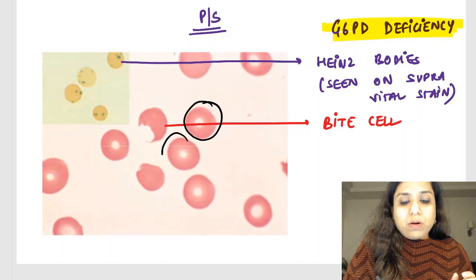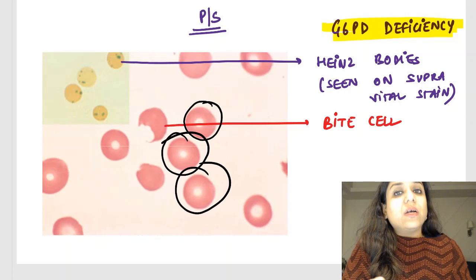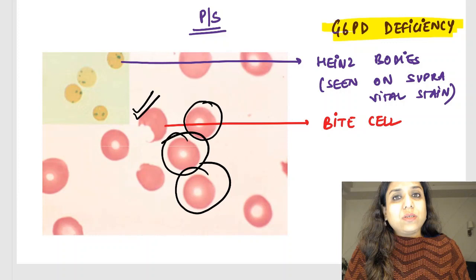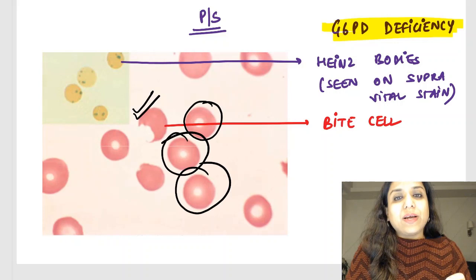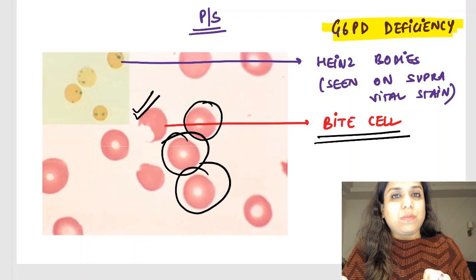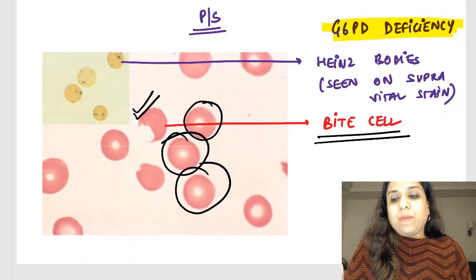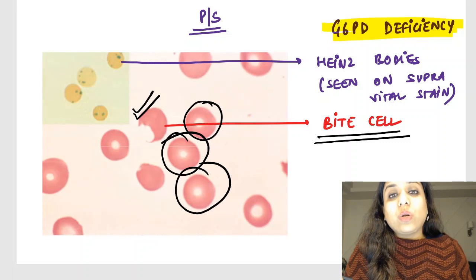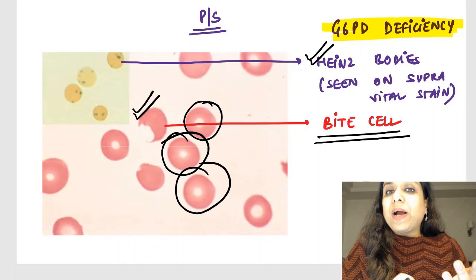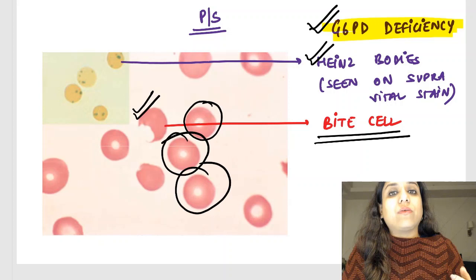These are the normal RBCs. They have a central pallor of approximately one-third. Now can you appreciate this RBC? Don't you think it appears as if somebody has come and bitten off this RBC? That is why these are called bite cells. When you do a vital stain — brilliant cresyl blue or new methylene blue — what we see are Heinz bodies. If the examiner asks you, bite cells and Heinz bodies are seen in G6PD deficiency.